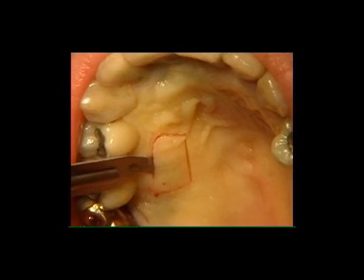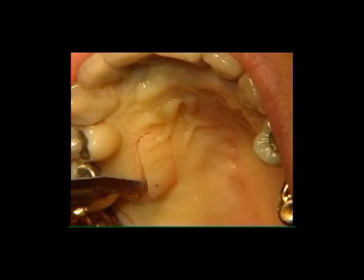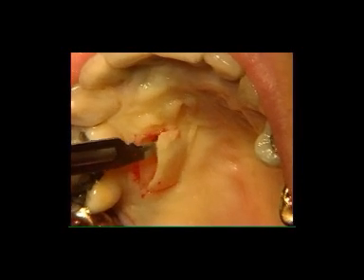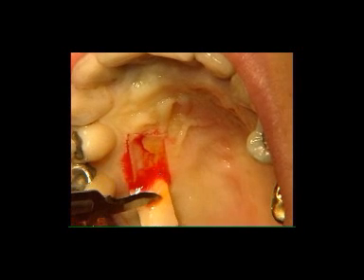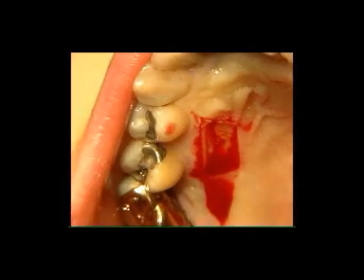It is very important that the flap isn't too thin in order to avoid removing almost exclusively epithelium, and not too thick in order not to include glandular tissue in its thickness. When the epithelium connective tissue graft has been removed, a palatine suture is performed.